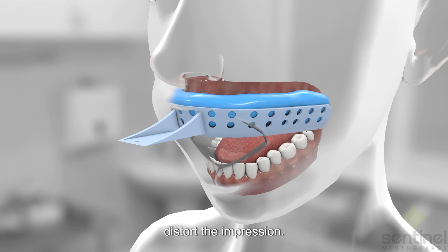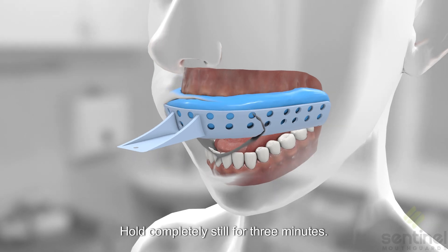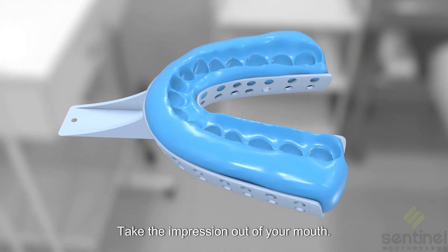Be sure not to move around, as it can distort the impression. Hold completely still for three minutes. Then take the impression out of your mouth.